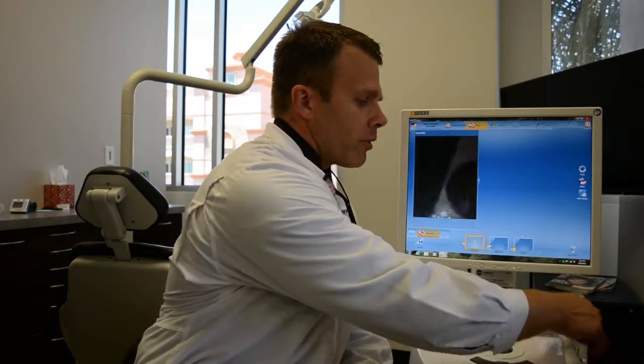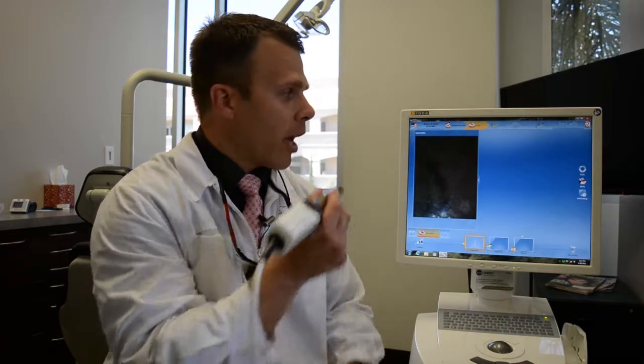I'm just going to do a small demonstration of how it collects data and I'm going to use my own mouth. This is one of the crowns that my brother did on me using this before he got his own. So I'm just going to collect the data.